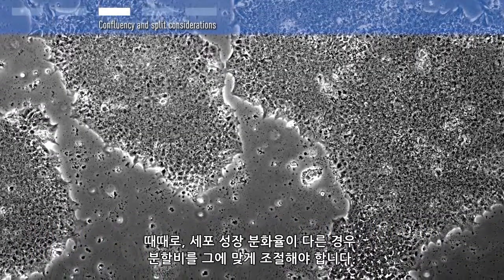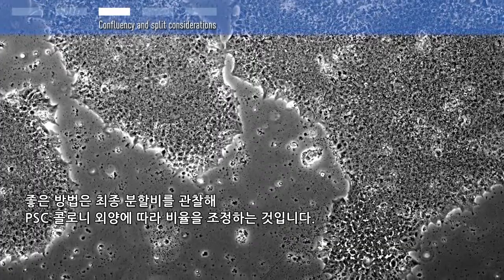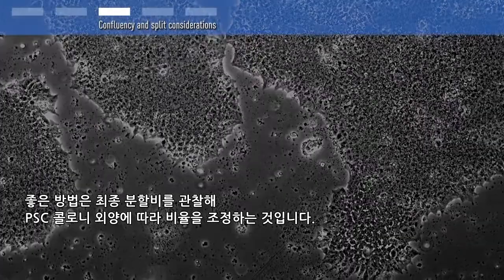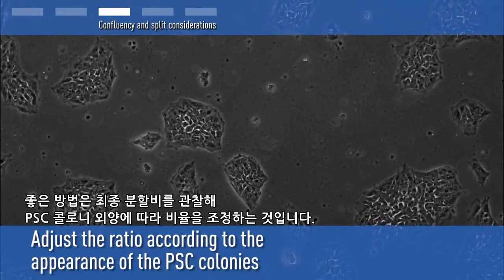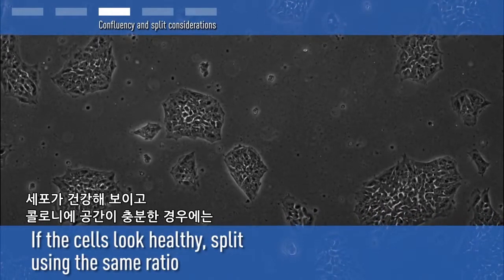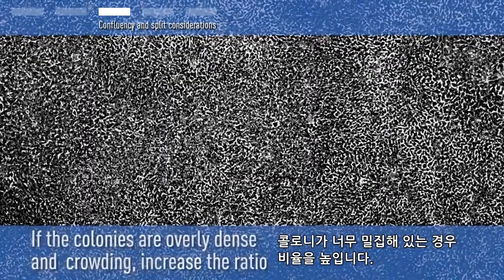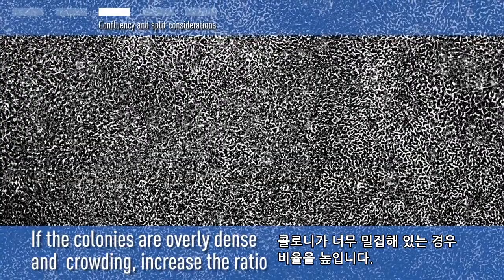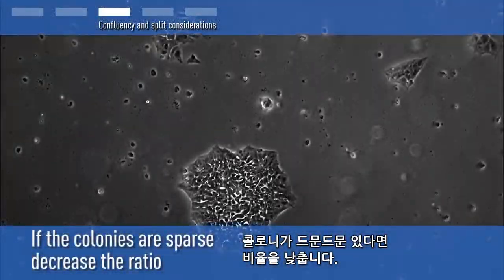Occasionally, cells will grow at a different rate and the split ratio will need to be adjusted. A good rule is to observe the last split ratio and adjust the ratio according to the appearance of the PSC colonies. If the cells look healthy and the colonies have enough space, split your cultures using the same ratio. If the colonies are overly dense and crowding, increase the ratio. If they are sparse, decrease the ratio.